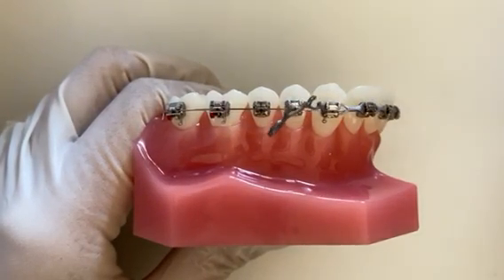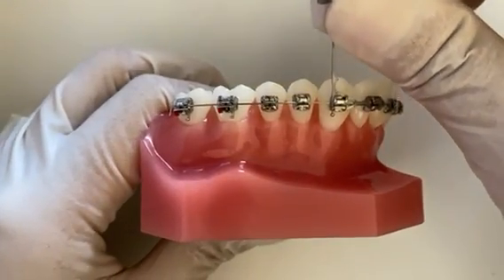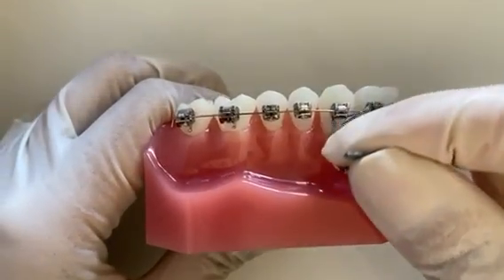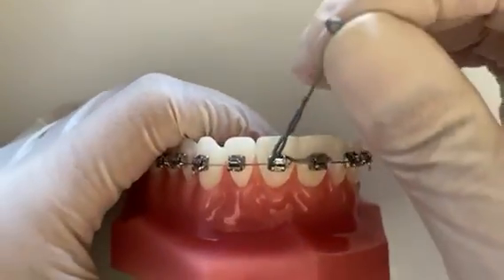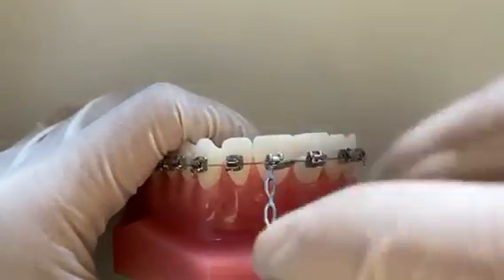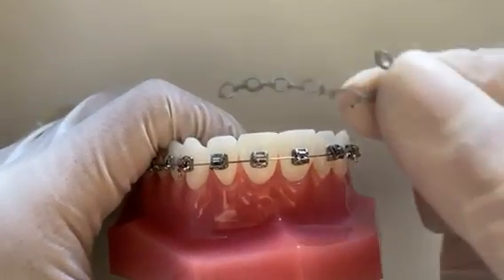Then you can use some pressure, as the chain is stretchy, to manoeuvre off each bracket by moving backwards to forwards. If the broken power chain isn't causing any discomfort, you can leave it as is and we will replace this at your next appointment when we see you.